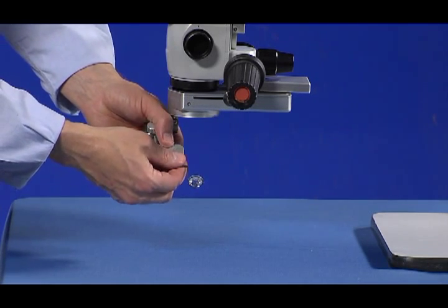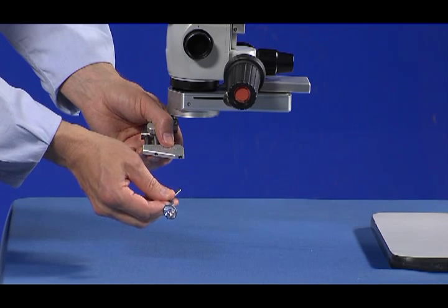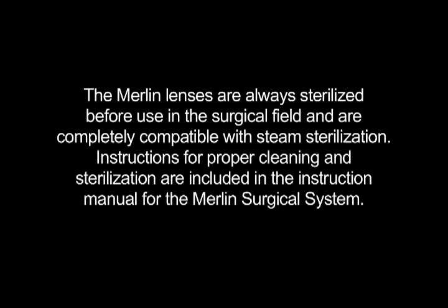Remove the lens by gently pulling the lens from the LPU. The Merlin lenses are always sterilized before use in the surgical field and are completely compatible with steam sterilization. Instructions for proper cleaning and sterilization are included in the instruction manual for the Merlin surgical system.